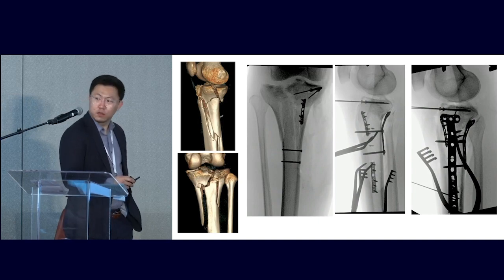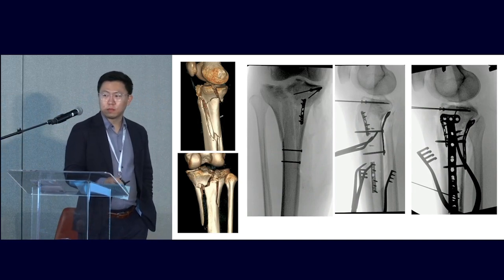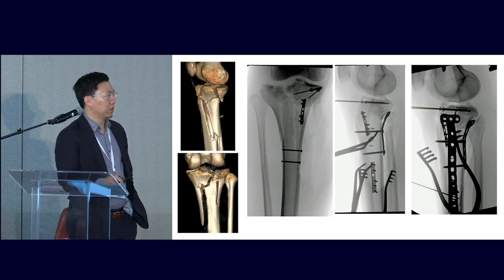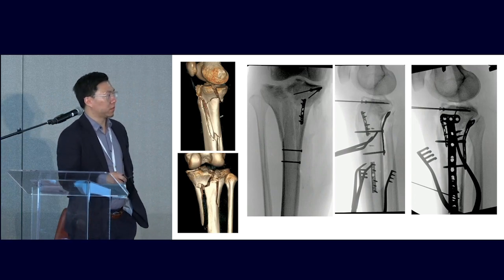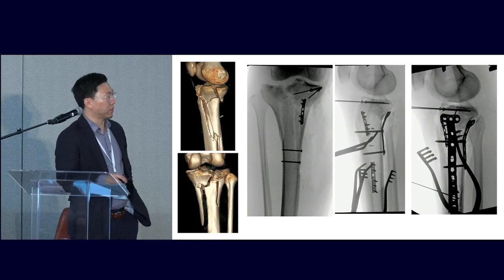Do you ever do a submeniscal arthrotomy, or do you judge your articular reduction by the cortical key there and then fluoro? Personally I use fluoro more often, but occasionally I might need to take a look in the joint if I'm having trouble.